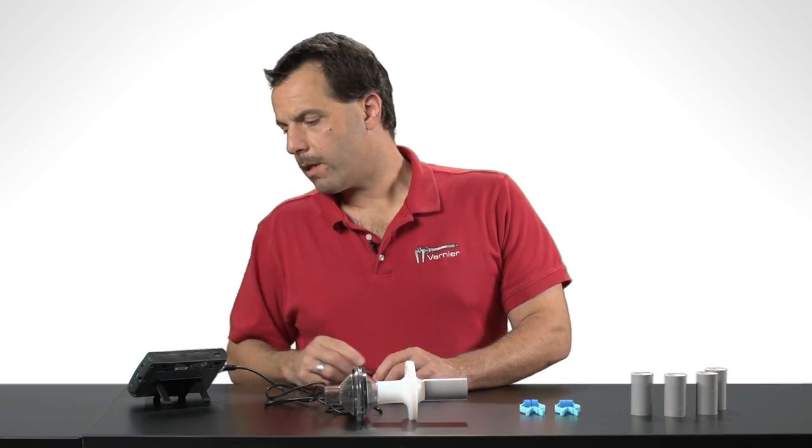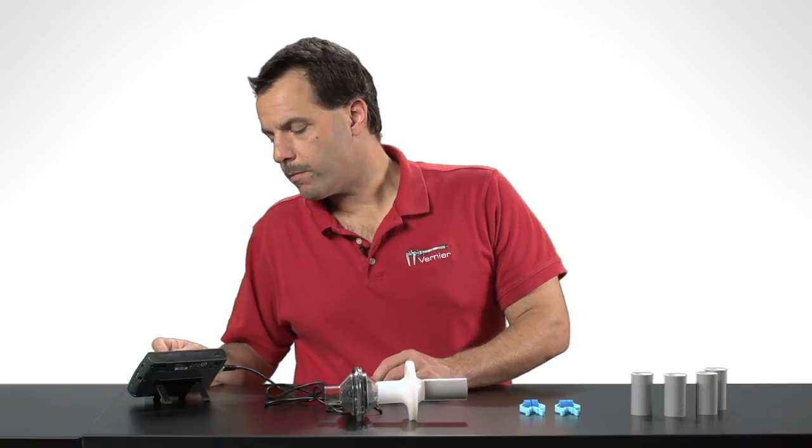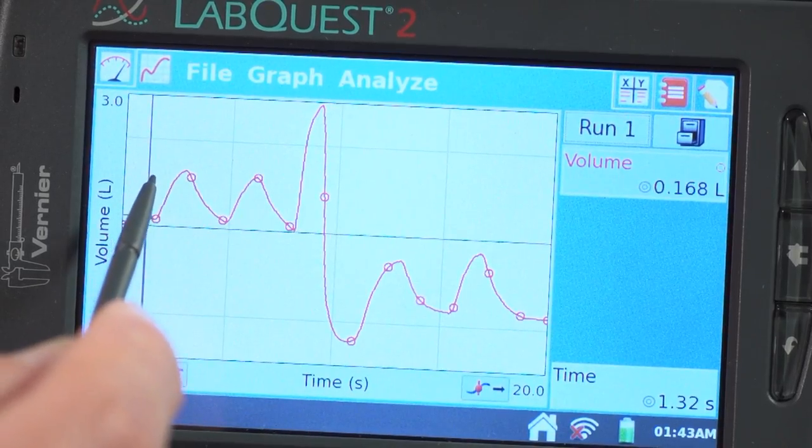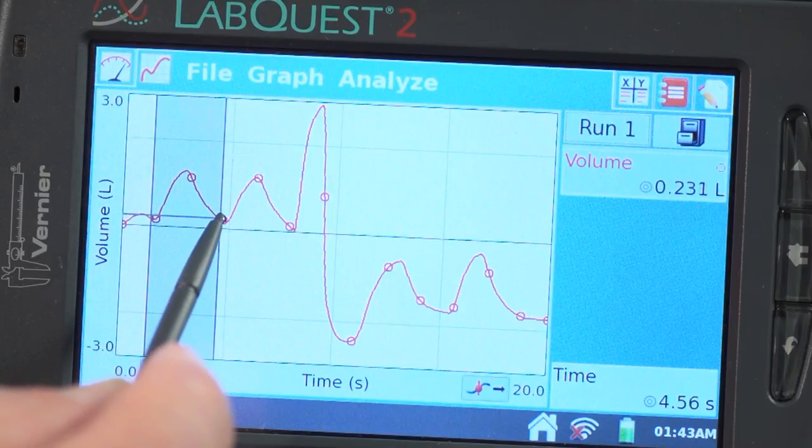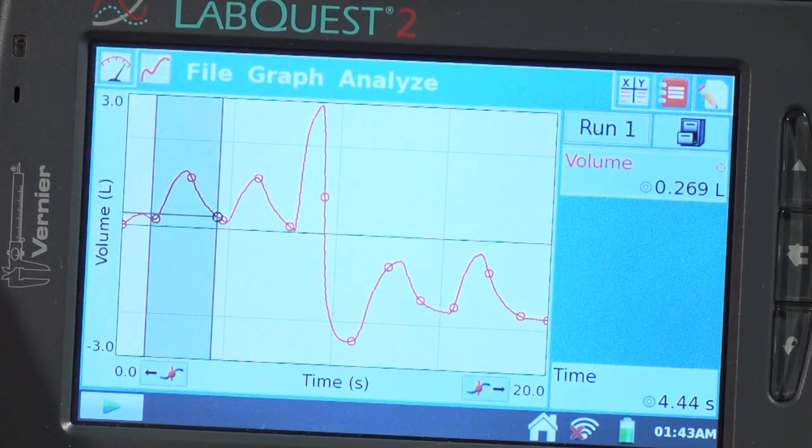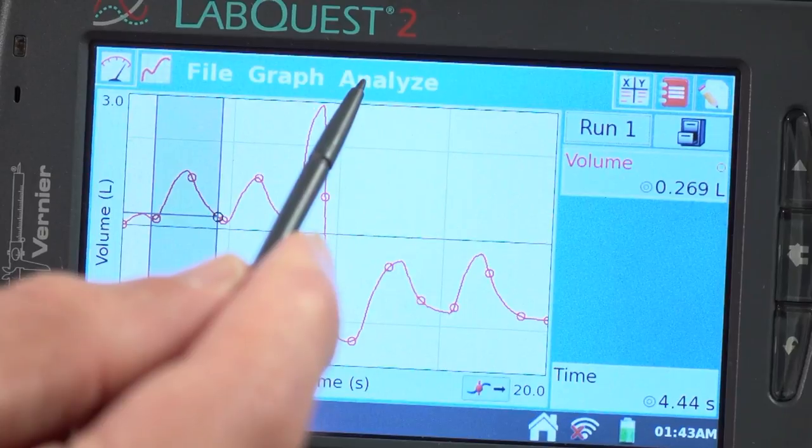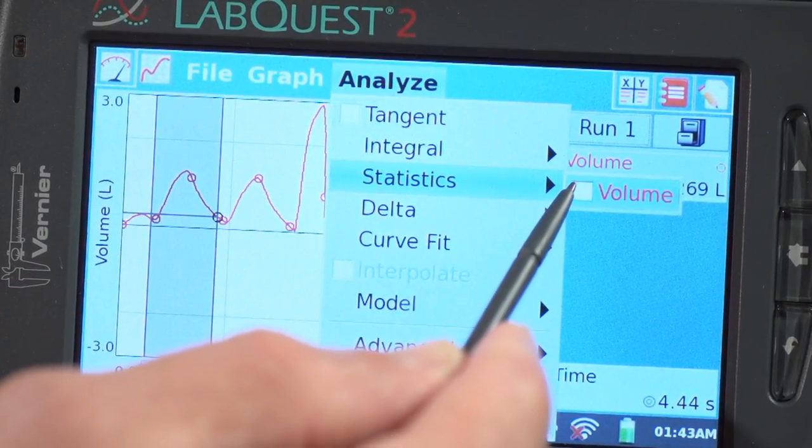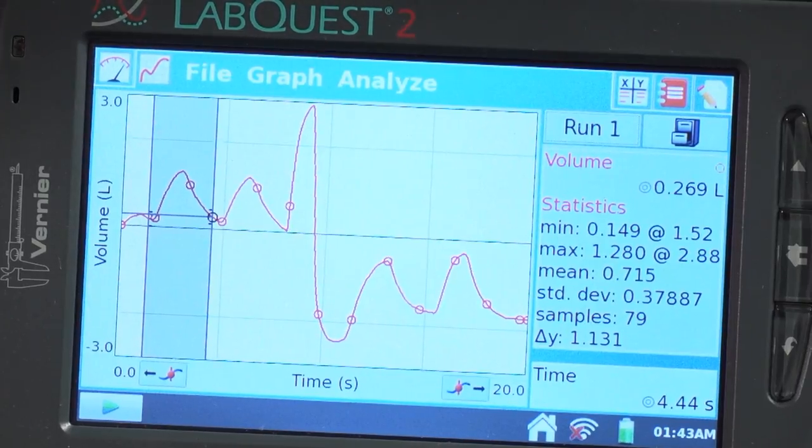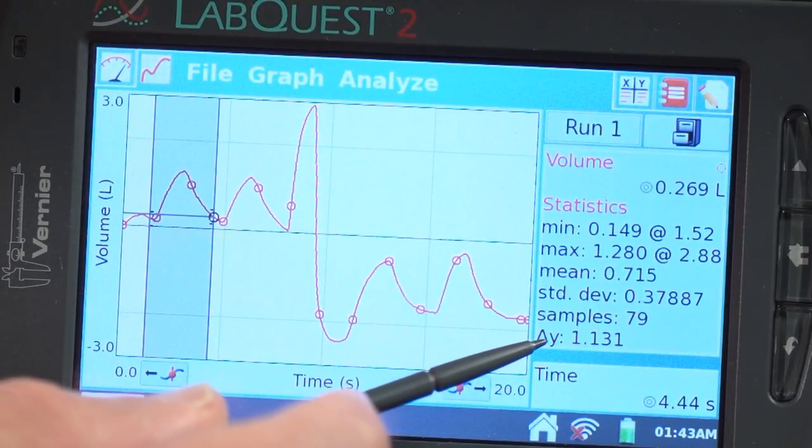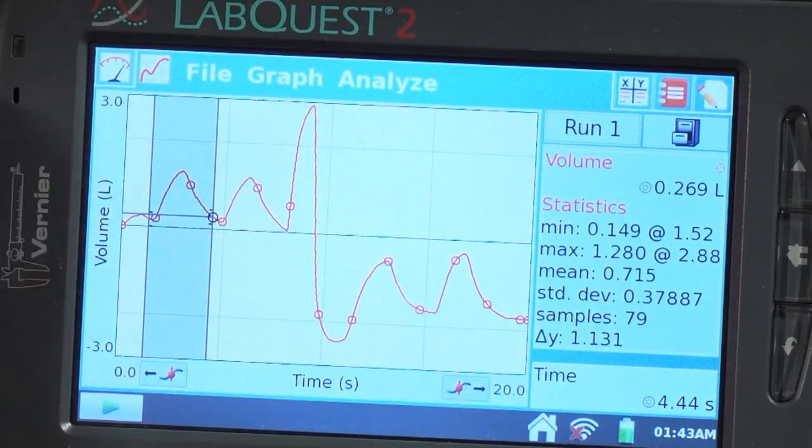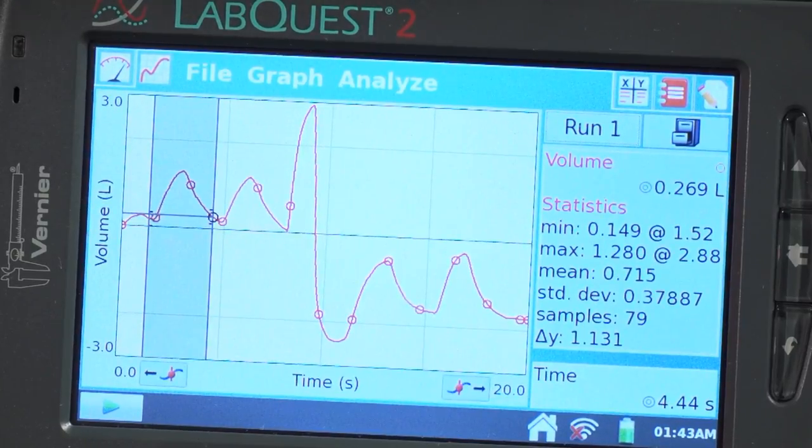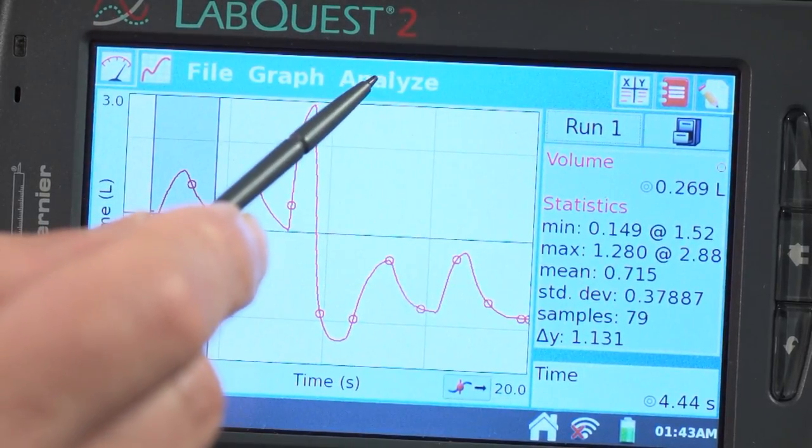Alright, so now that I've done the baseline adjustment, let's just calculate some tidal volumes here. So I can select a region here. That's one tidal volume. And let's go to Analyze and go to Statistics. Select Volume. And you can see right here the delta Y, that's about 1.131 liters.